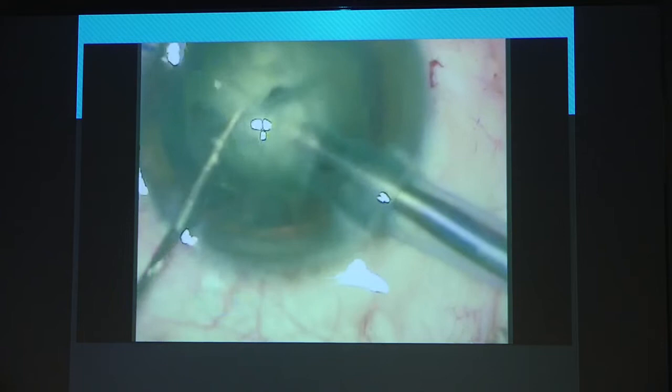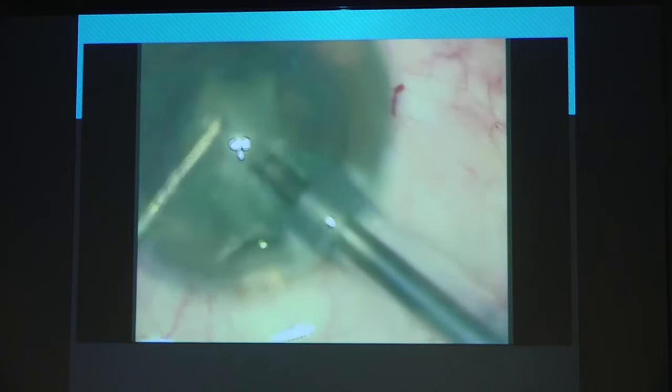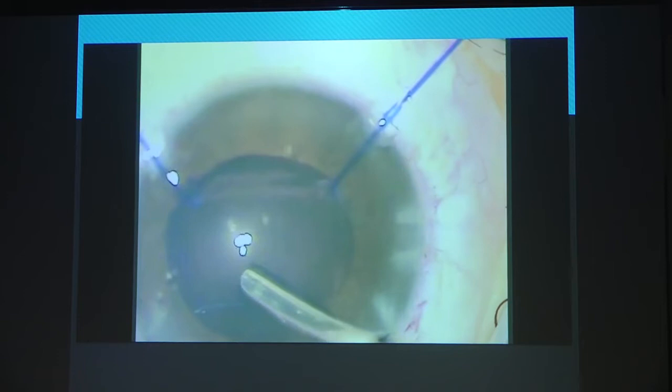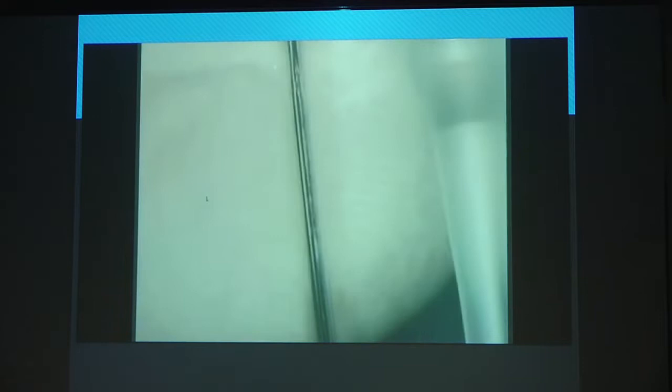Then you do a little bit of dissection, prolapse the lens out, and using a negative suction technique, just gradually remove the nucleus. Notice everything is moving very slowly, which is what you want. Then finally you remove your cortical pieces which are left over — very important to remove them, otherwise you are going to be left in trouble. Then you put in a capsular tension ring. These are the times you really want it. Start the tension ring from the place where it is starting to prolapse just a little away, and then let the capsular ring push the prolapsed part back in.